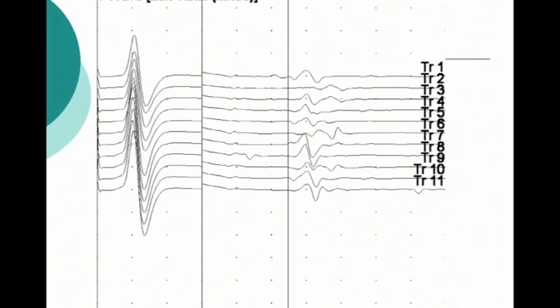Now, let's go to the F waves. F waves are these small motor responses that you see after the motor potential, and that you study after you've done the motor response in a nerve, because the F wave goes all the way back to the neck or to the back, namely to the anterior horn cell, and comes back. So it's very useful in root lesions. Now here's a very nice F response. You can see that there's a nice motor response or M response on the left. And you can see that it's reproducible throughout all of these.